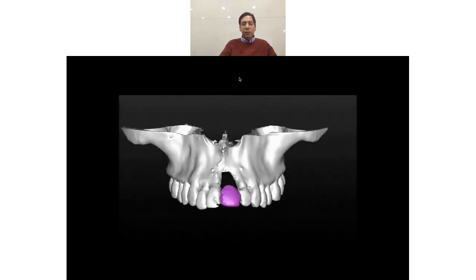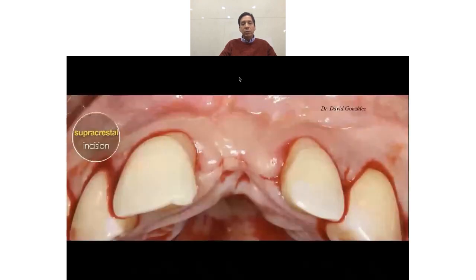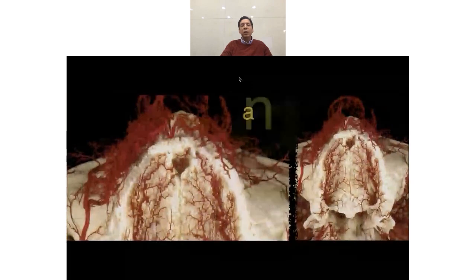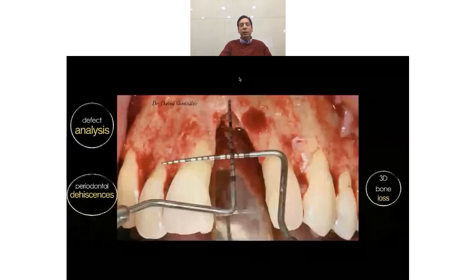We can see here the destruction, no palatal bone wall, but even though we have no bone in the palatal aspect, we will go for the same approach as always. So I mean, we do a supracrestal incision. Why? Because, as I explained before, I want the palatal flap totally vascularized, and also the buccal flap.